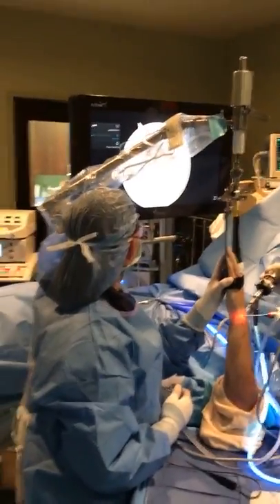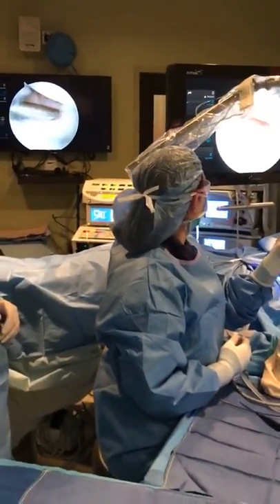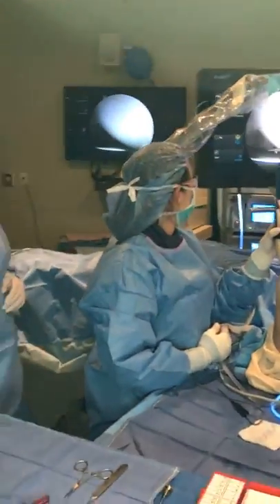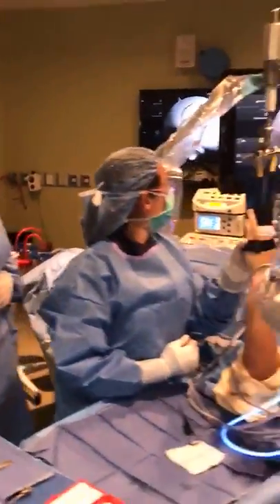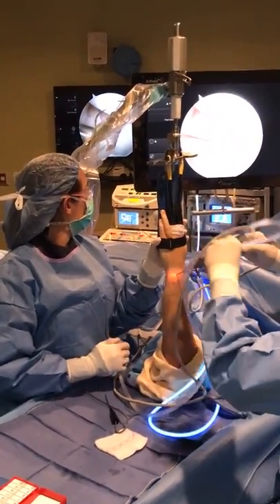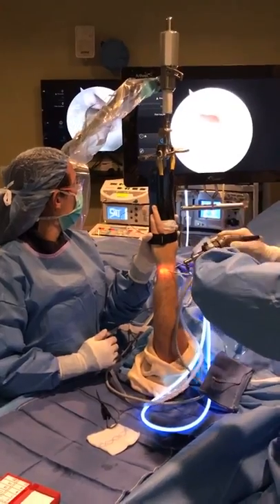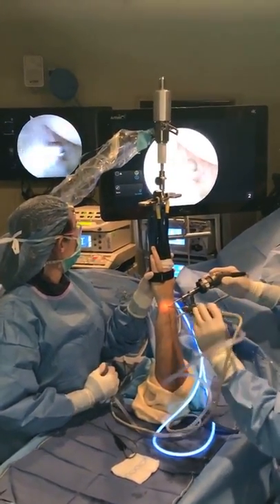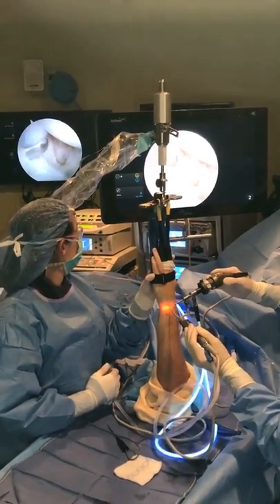Now, unfortunately, I have another issue now with the cartilage loss, but his cartilage is perfect. You see it there? It's just white, pristine. If there was any defect here, we would call that arthritis, basically. And he does not have that. But what I'm worried about here is this seems to be detached. And it attaches on the capsule.